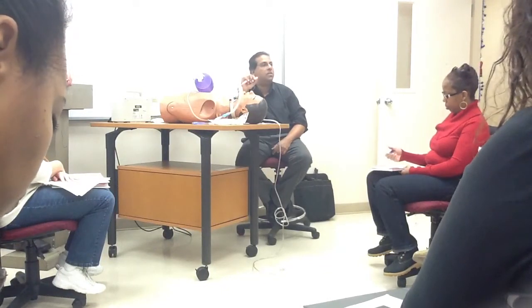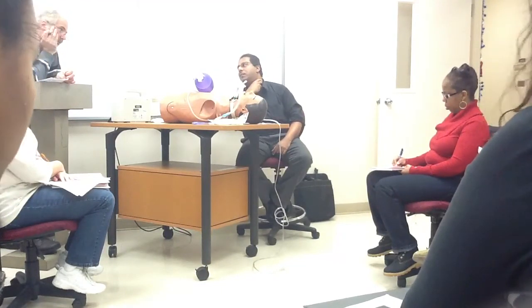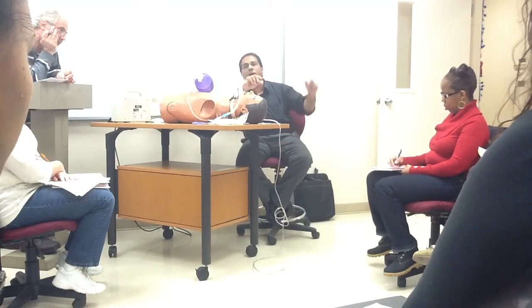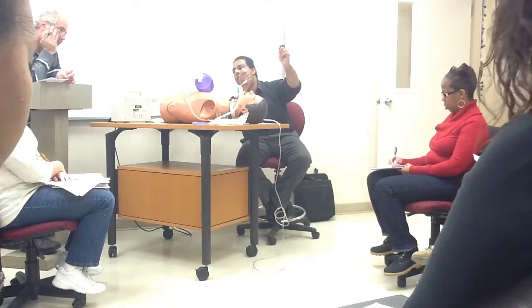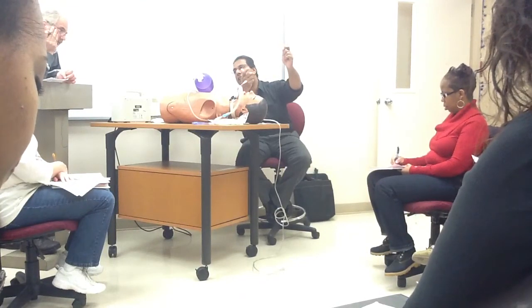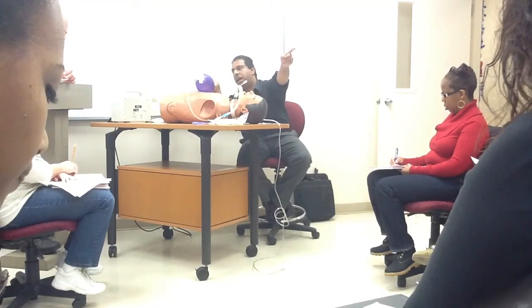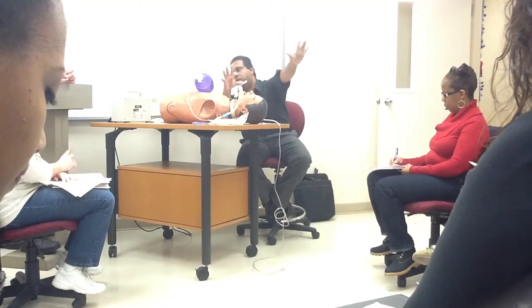The question is not only hyperoxygenate them, do you want to hyperventilate them? Yeah, you do want to hyperoxygenate and hyperventilate the patient. Well, you cannot hyperventilate somebody with a trach collar. What you can do is ask them to take deep breaths while you're turning the dial up to 98%. And if they can do that, you don't need a bag. You turn the dial up on the bottle.